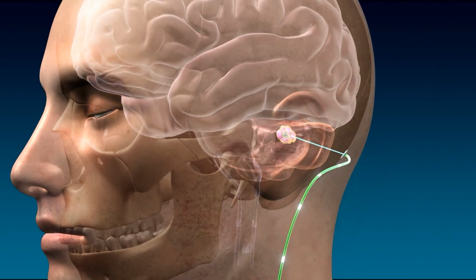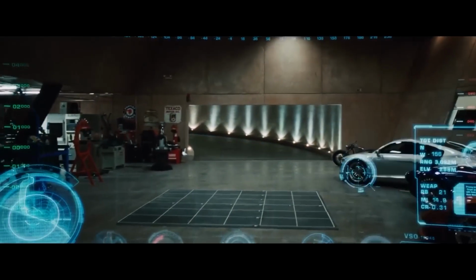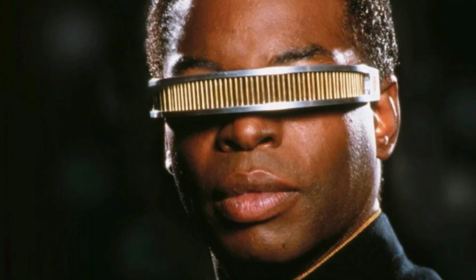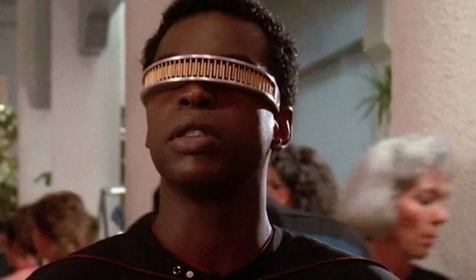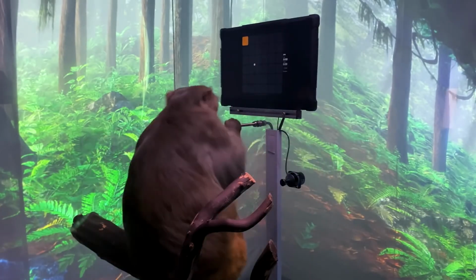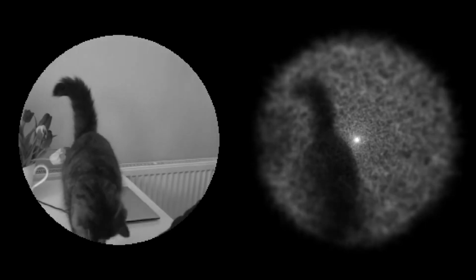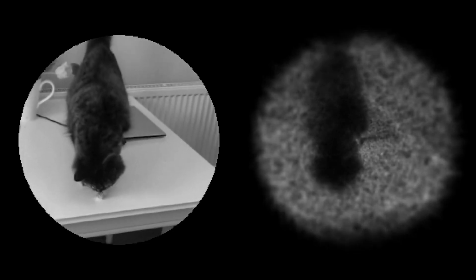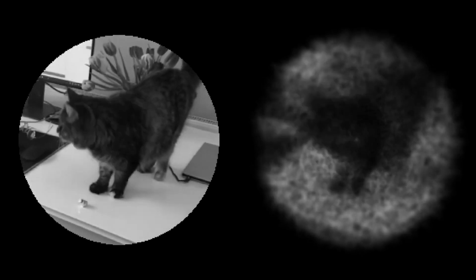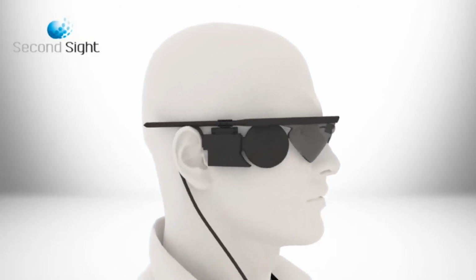Another amazing possibility with the chip is restoring or even enhancing vision, because eyes are also an input device, a middleman, and the important part is the visual cortex, where signals can be sent by stimulating it. Back in 2020, which already feels long ago given tech development speed, there was a study where a monkey with an implant could recognize simple shapes, movement, and letters. This year, Neuralink announced a chip that will help restore vision called Blindsight, and the FDA calls it a breakthrough, which it really is, because stimulating the brain can eventually make vision better than human.